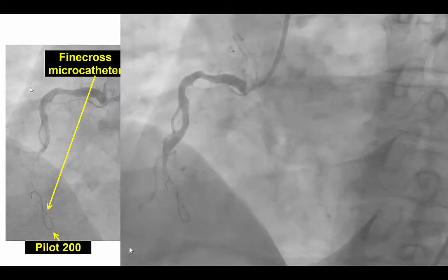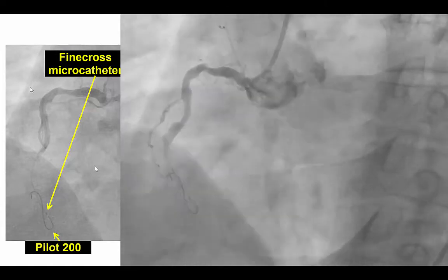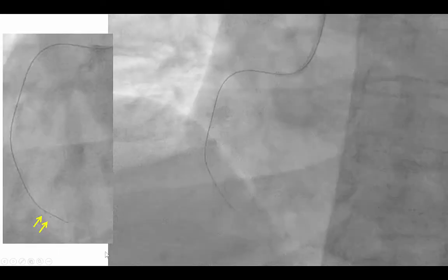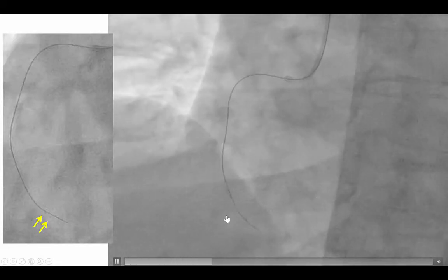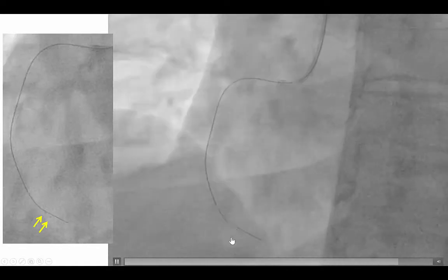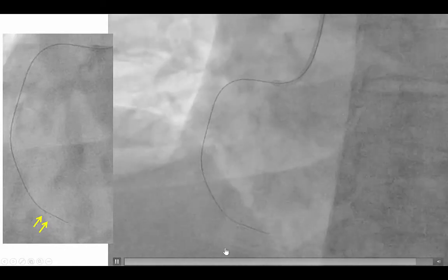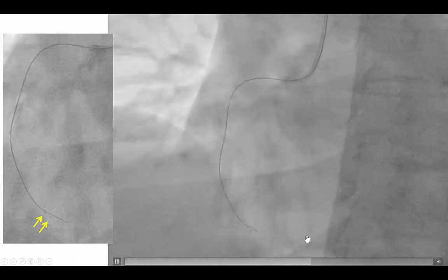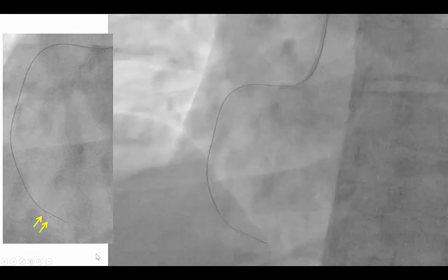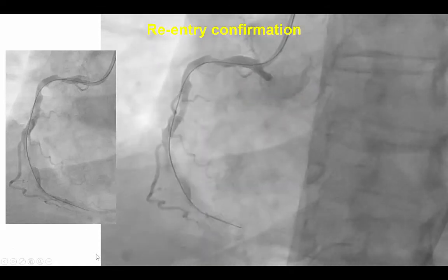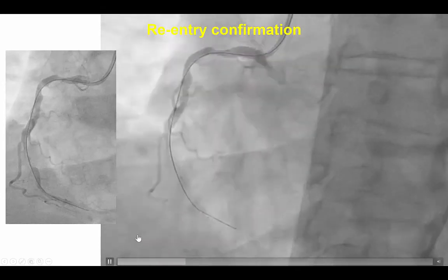We used a Pilot 200 guide wire through a Finecross microcatheter to advance in the subintimal space distal to the area of dissection. We then used the Stingray balloon, which was delivered easily because of the lack of calcification, into the distal right coronary artery. We can see the Stingray wire exiting proximal to the proximal marker of the Stingray balloon and re-entering into the distal vessel. Re-entry was very easy because this vessel was not occluded and was of large caliber. The next step was confirmation that we were in the distal true lumen, and indeed the wire was in the distal right coronary artery.